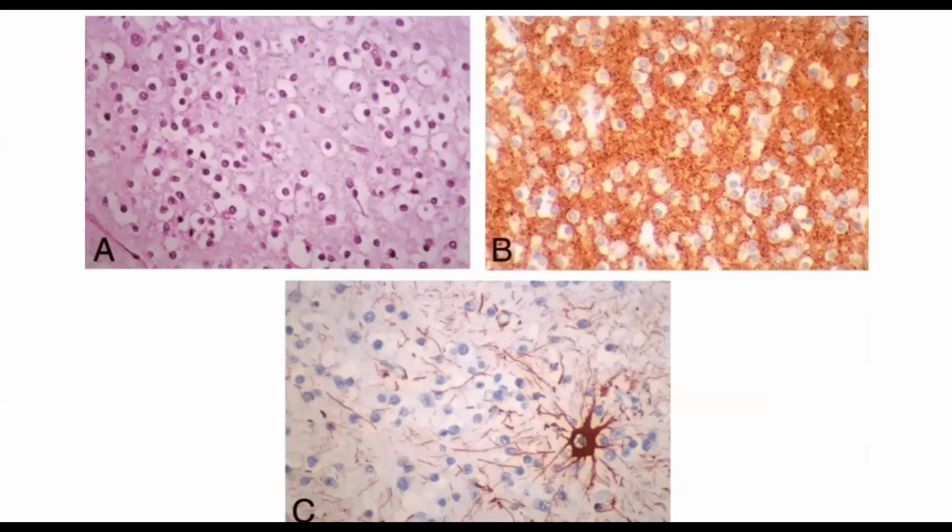Okay, here is the central neurocytoma. You can see in the upper left, fried egg artifact. Remember, central neurocytomas mimic oligodendroglioma beautifully, right? But they're growing in the ventricle, not in the parenchyma. And in panel B here, they stain intensely for synaptophysin. In panel C is GFAP. You can see reactive astrocytes because they do arise, central neurocytoma, from the septum near the interventricular foramen of Monro. So there's going to be a border zone there. And also the neurocytoma cells themselves can, upon occasion, a subpopulation can express GFAP. They're neuroectodermal. There's no surprise there.